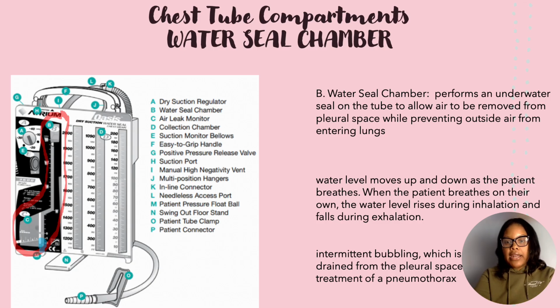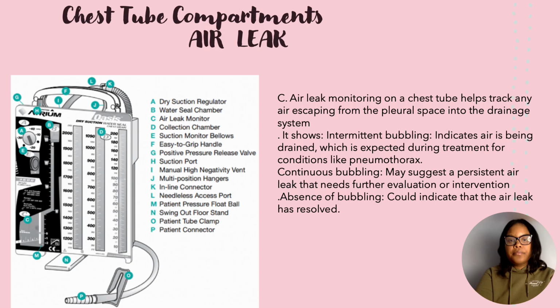You're like, Dr. Bonnet, where are we looking for our bubbling? We are looking for the bubbling in the wider part. So we're going to see bubbling in the wider part, and we should see tidaling in the skinny part of our chamber. Does that make sense? All right, the next slide is going to go into a little bit more depth on the wider part of the water seal chamber.